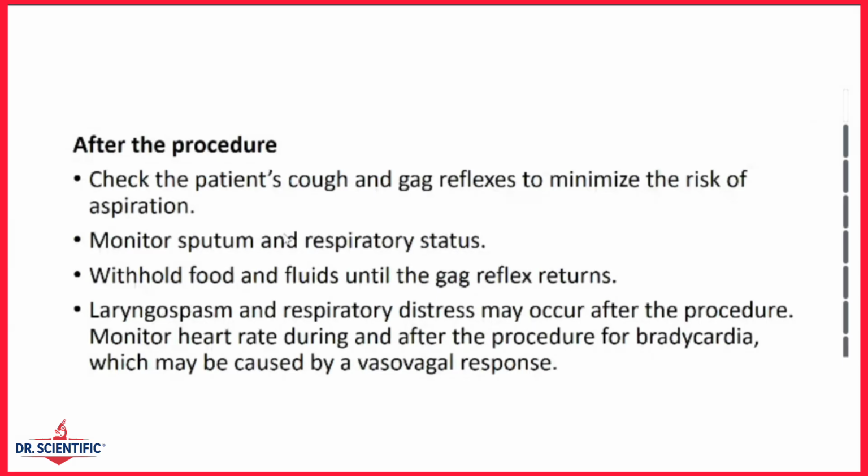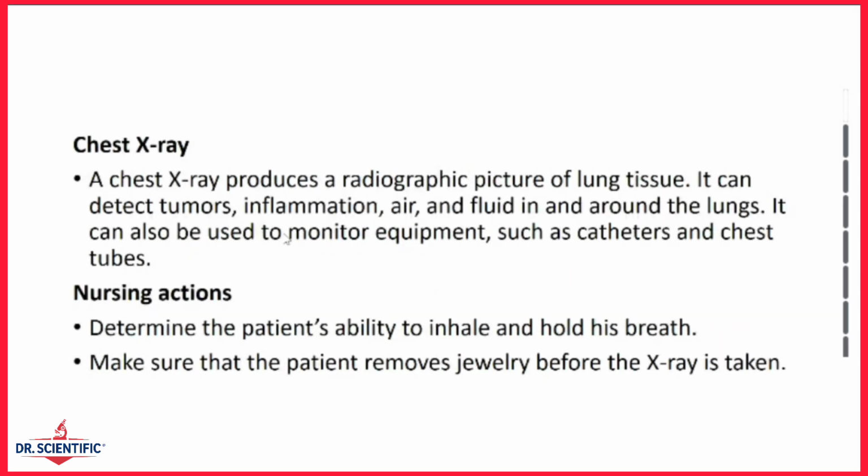Chest x-ray, which we are all familiar with, is a very common diagnostic procedure. It's a non-invasive radiographic examination. It can produce the image of the lungs, the heart, the diaphragm, and the bones that surround it.